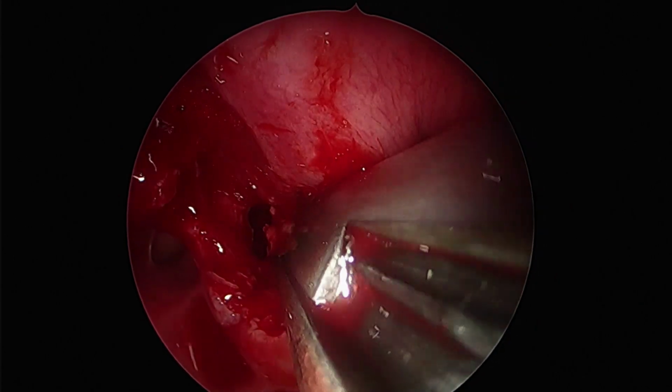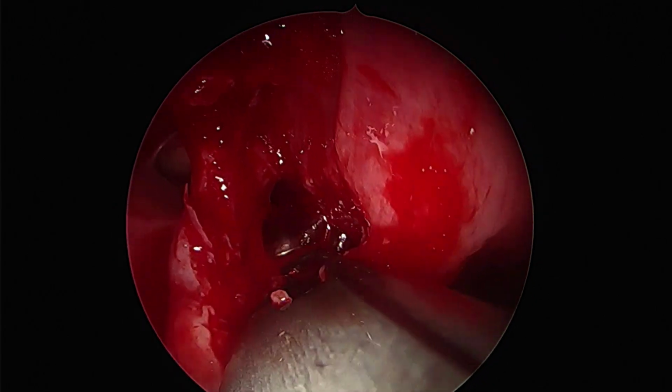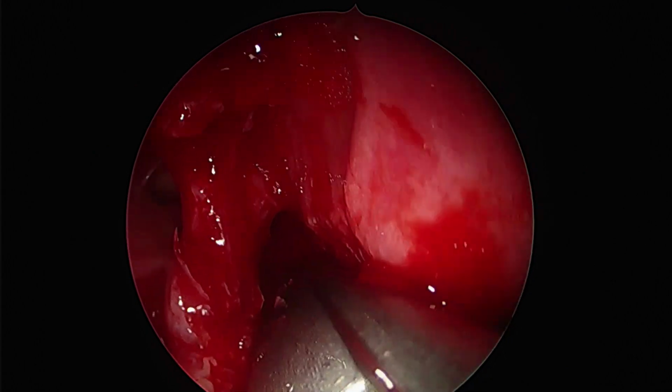Here we are enlarging the os slightly more towards the septum and inferiorly, where it is quite safe.